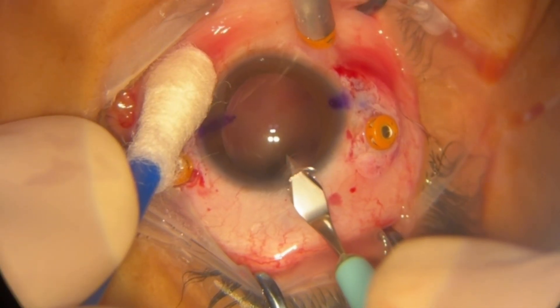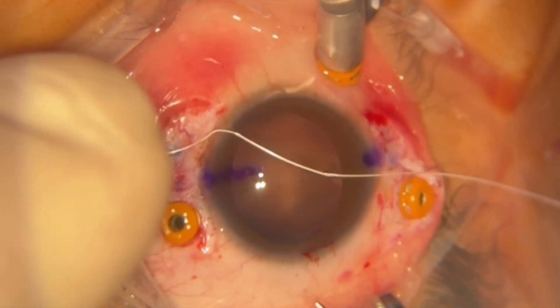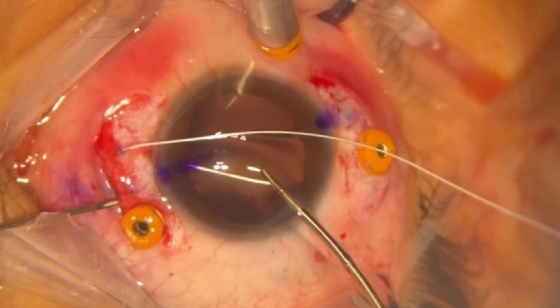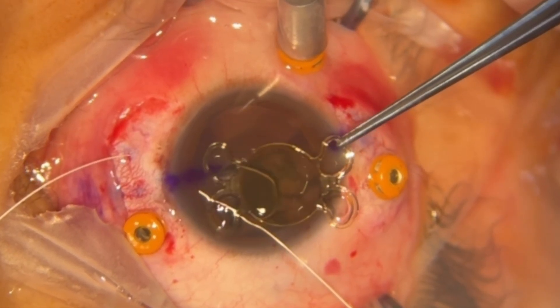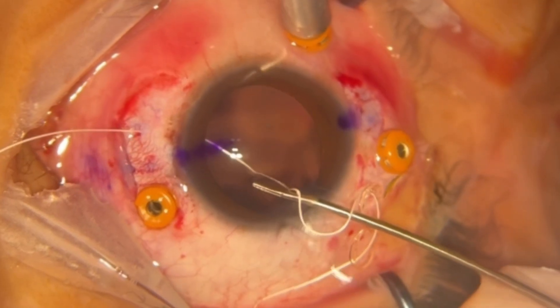Once the vitrectomy is completed, scleral fixation of the intraocular lens with Gore-Tex sutures is initiated. The thread is passed through a 29-gauge needle and then introduced at the inferior scleral marking to be retrieved with forceps. The thread is then passed through the loops of the BVI isopure lens.